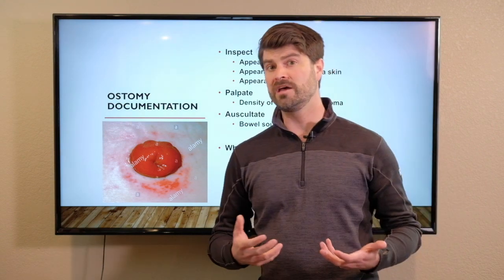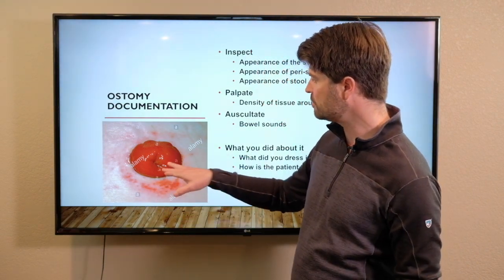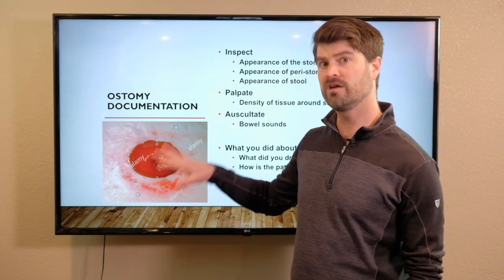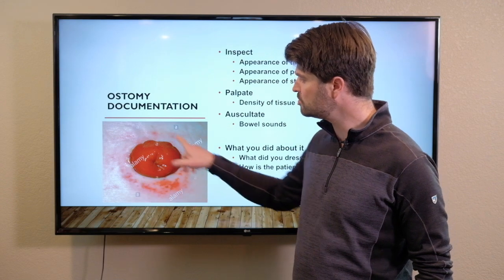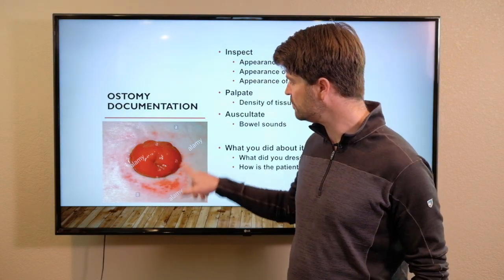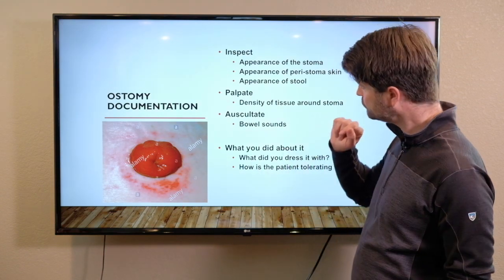When we document, this is also what the stoma should look like. This is a very healthy looking stoma. So nice and pink, moist, looks great. No signs and symptoms of drainage or infection around the insertion site. That is a normal looking stoma.